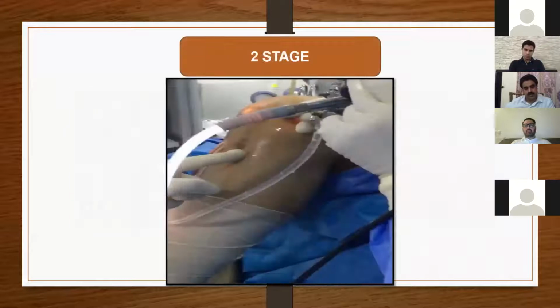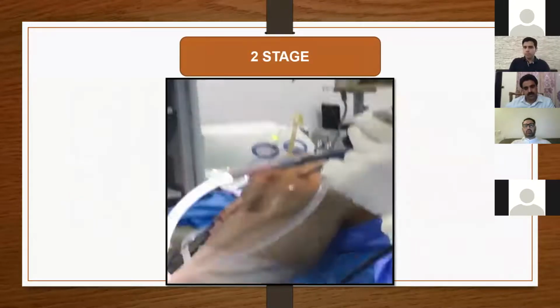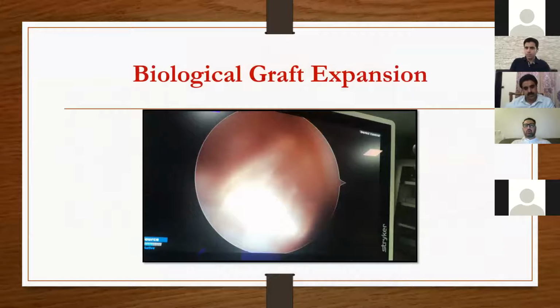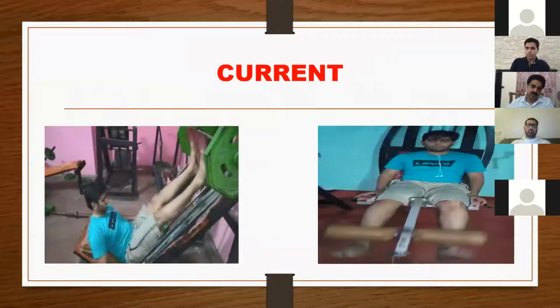And then I did second stage using hamstring. And as you can see, nice, beefy, and juicy graft. Using endo button on the top. I used PRP in most of my patients now. And this is his condition.